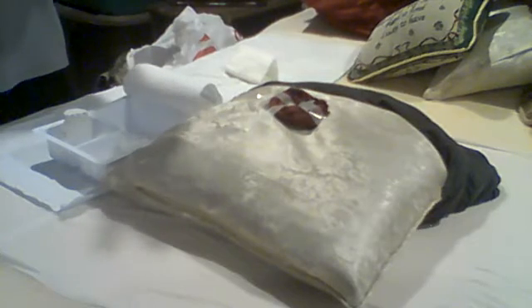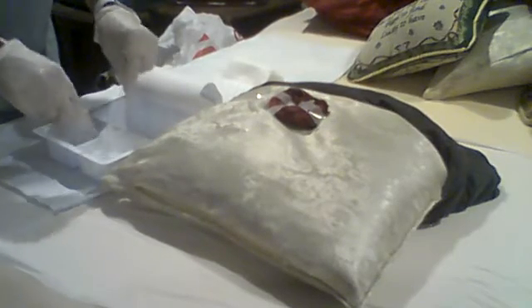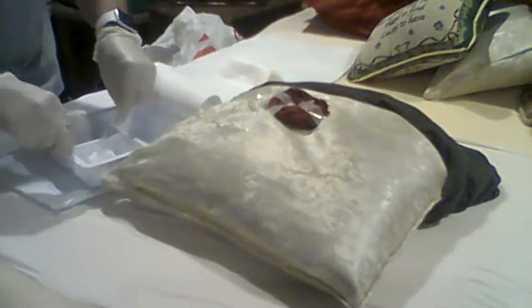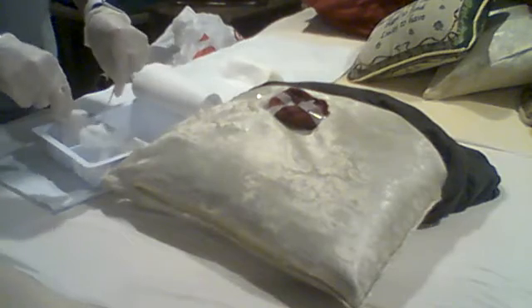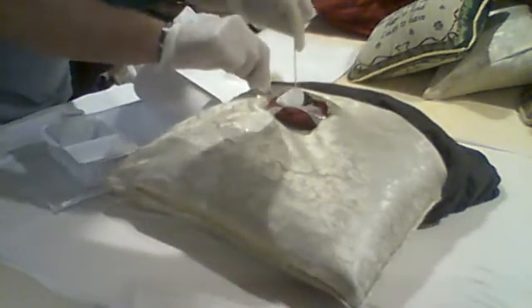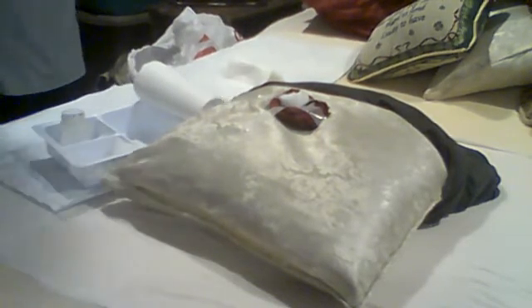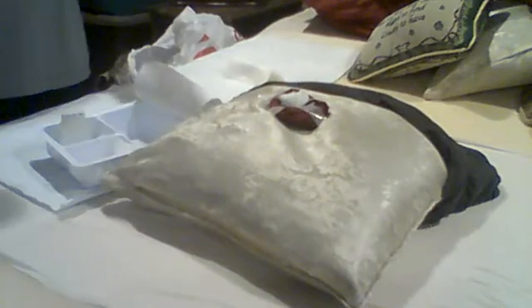So now what I'm going to do is I'm going to go ahead and get my gauze. I have my cotton swabs. I'm going to go ahead and get a gauze and pack this one. Then I'm going to stand away from my sterile field. Throw those away.